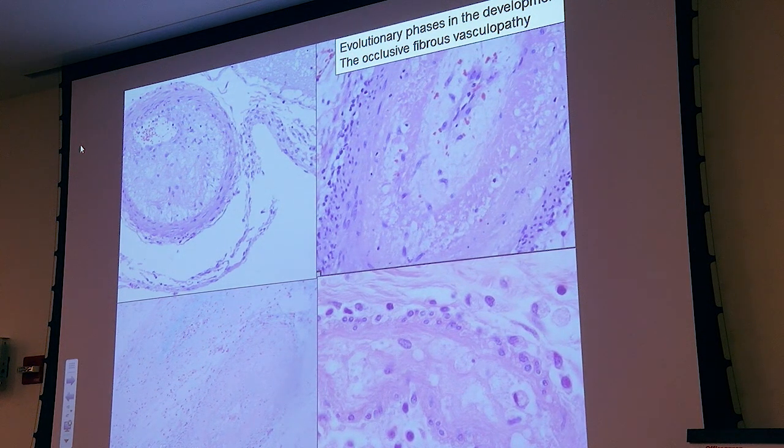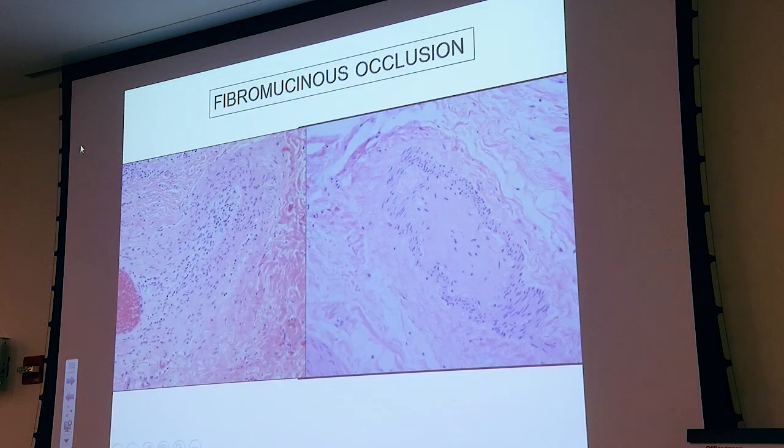And this particular vessel is completely occluded by this collagenous and mucinous thrombus. And again, the late stage lesion will literally be a plugged artery, plugged with collagen and mucin with a variable lymphocytic infiltrate that ranges from being lymphocyte rich to this scarred blood vessel.